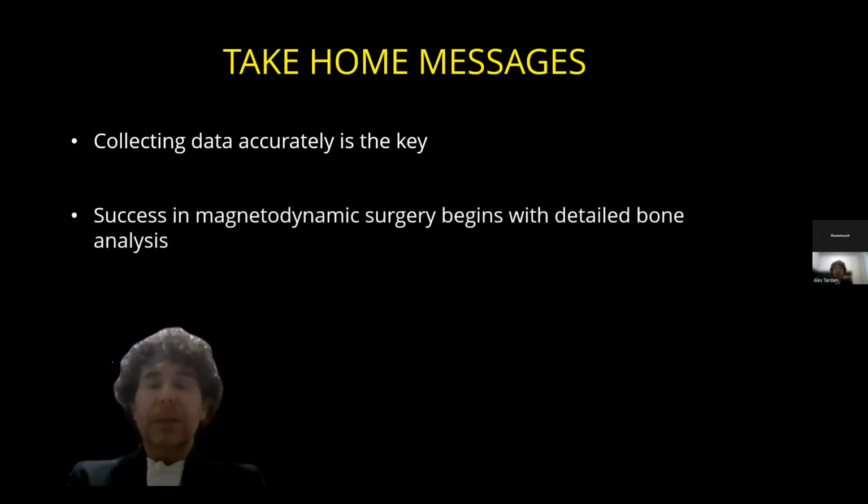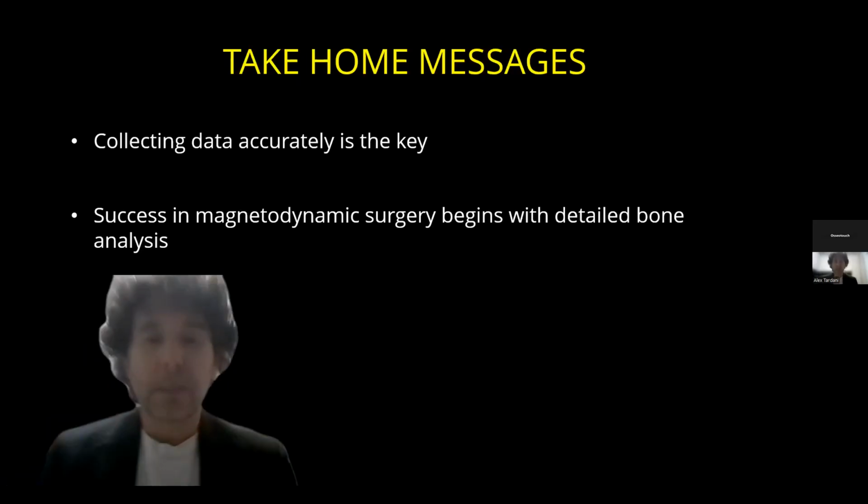Magnetodynamics involves another crucial detail that we must know how to interpret: bone analysis and understanding when our software, like all software, is dumb and gives us values that are not real, but are simply related to anatomical situations that we will assess and modify during surgery. So, as we saw earlier, there's the case of an extraction socket, or the use of biomaterials prior to implant placement, and so on.